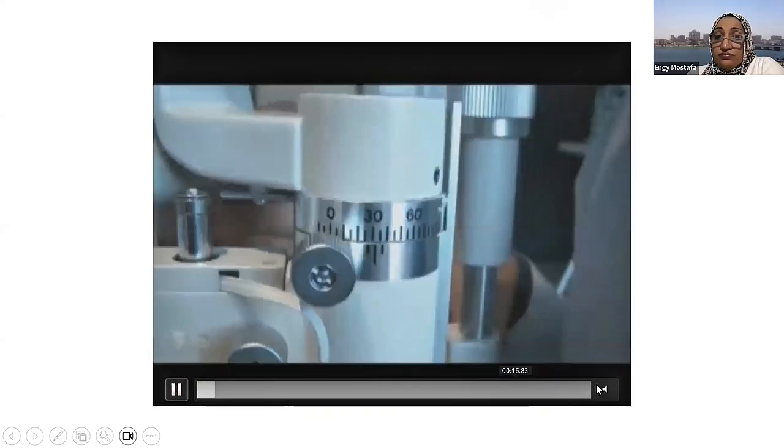So now we come to one of the least used techniques in our practice. Yet if we remember to use it, of course, it would add more to our diagnosis. It's called the sclerotic scatter. Okay, so this time we are going to make the light look away from the viewing system.